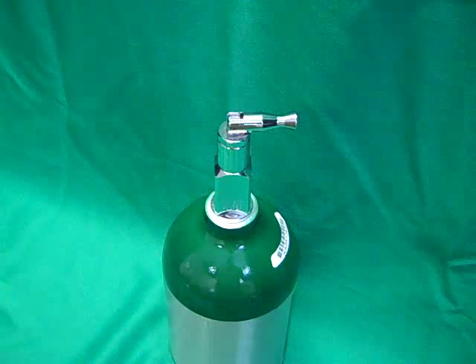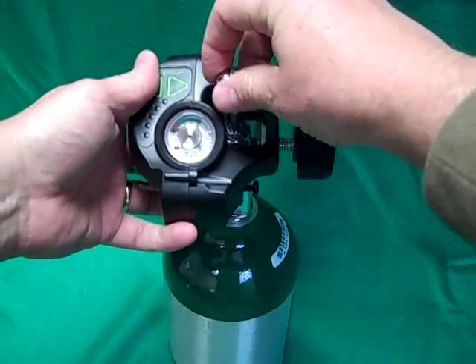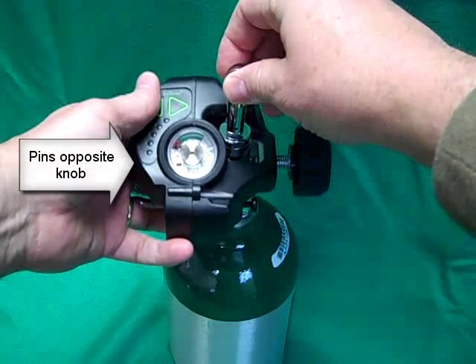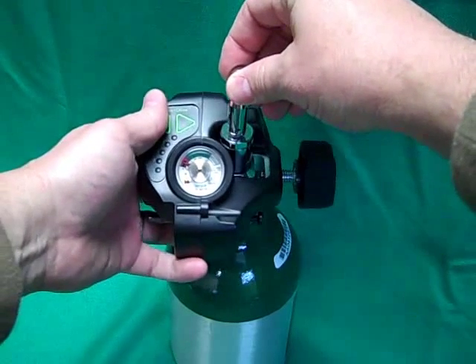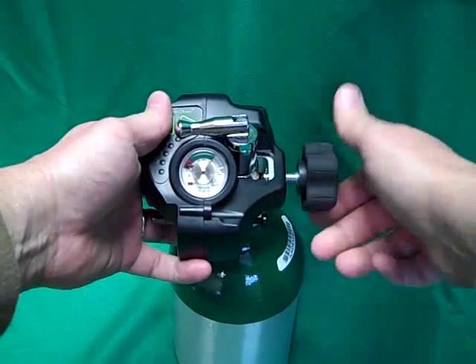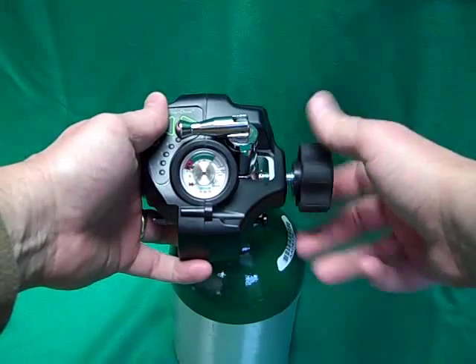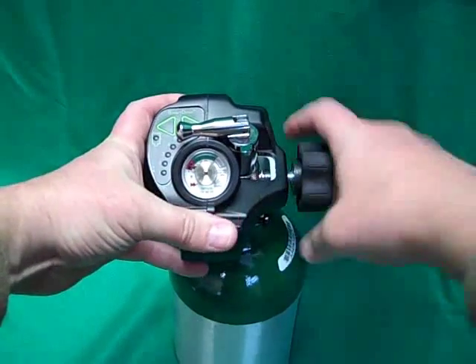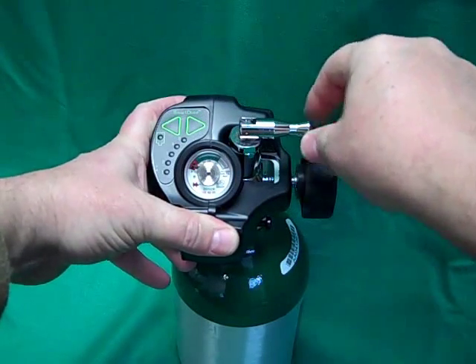To attach the SmartDose unit to a cylinder, simply assure that your orientation is correct and that the pins are aligned with the holes on the valve stem. With the SmartDose unit knob fully open, place the unit over the cylinder valve stem, take the unit to the bottom, and then with a slight side pressure to seat the pins, bring the unit back up until it seats. Tighten the knob and the unit is attached. You may now open the valve on the top of the oxygen cylinder to supply oxygen to the SmartDose Mini.